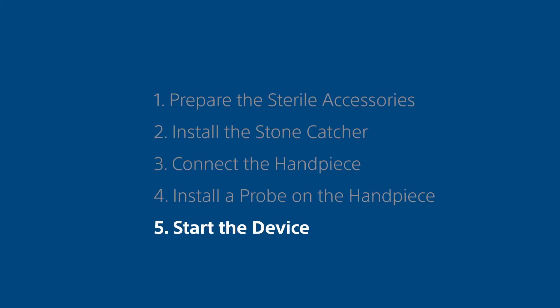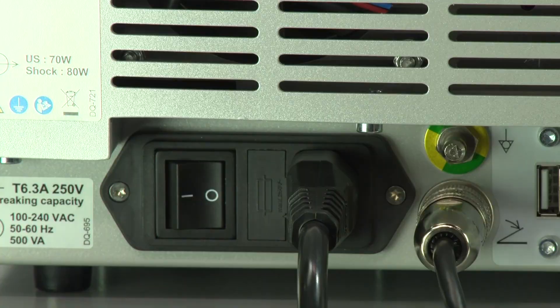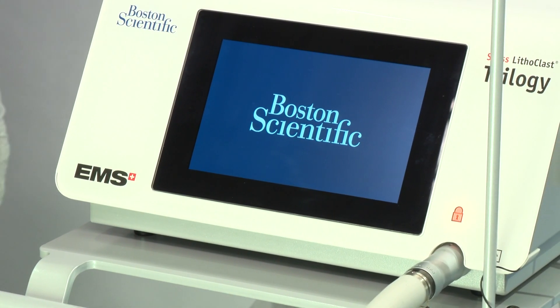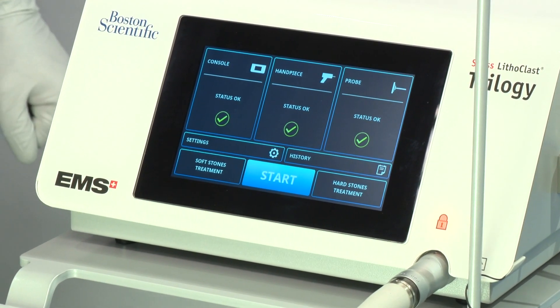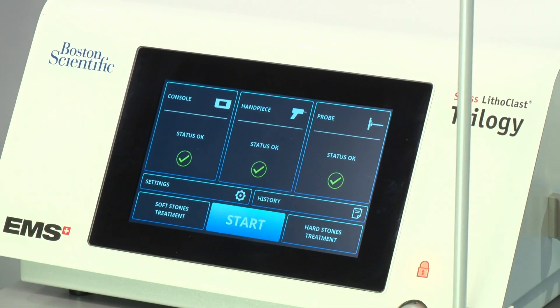Step 5. Start the device. Use the main power switch located on the rear panel to switch on the unit. Wait until the standby screen appears. The unit automatically performs a series of diagnostic tests and displays a green checkmark for each successfully completed test. The console is ready to use when all the diagnostic tests have successfully completed.